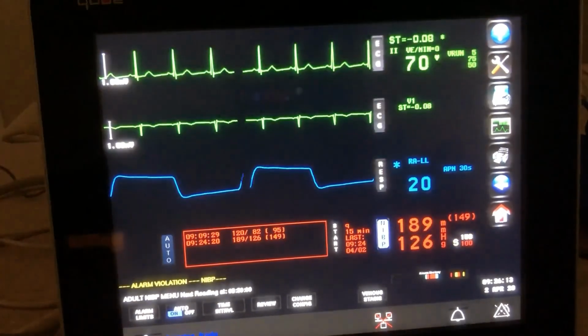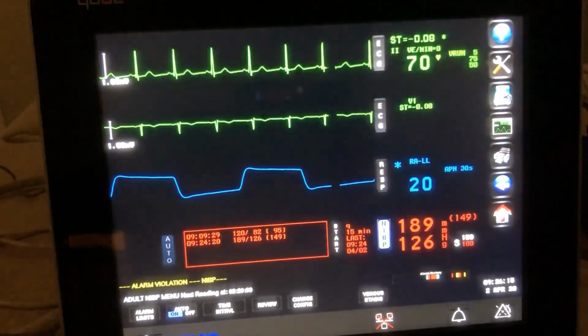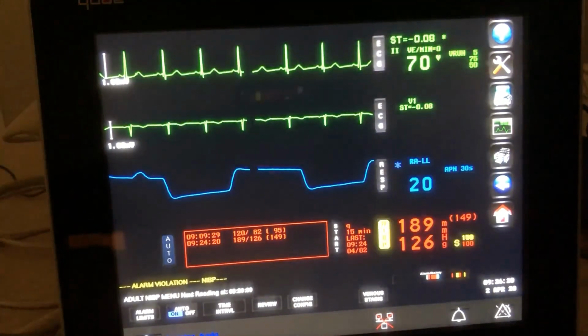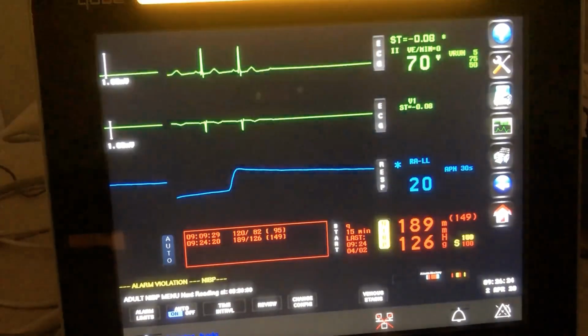And obviously if we wanted to, we can just come over to our tester. We can then, once the test is over, set our new value to a low value and retest the low alarm limit.